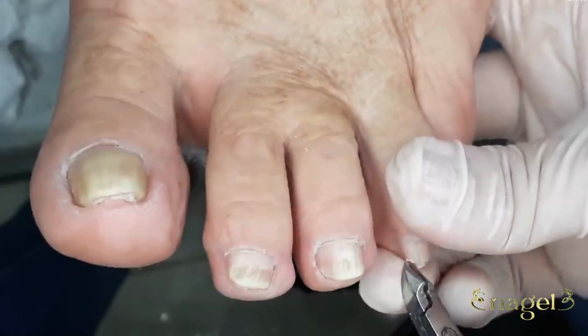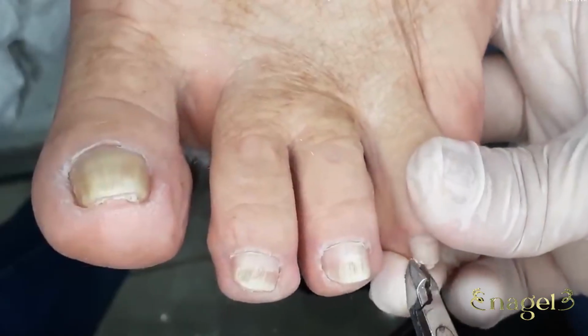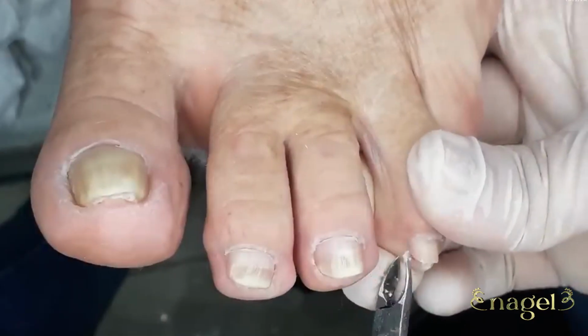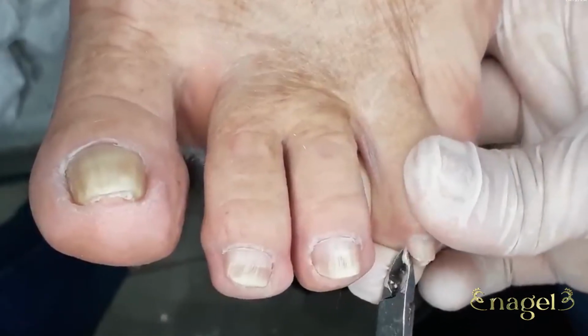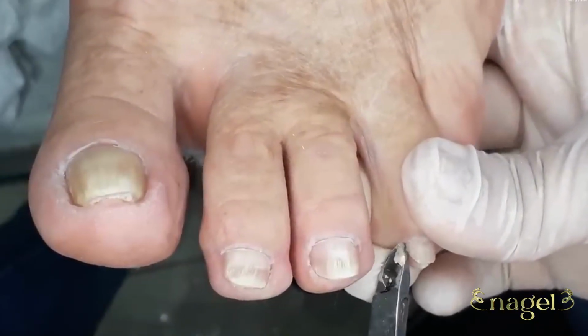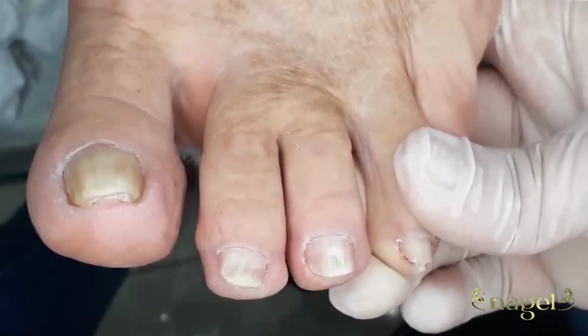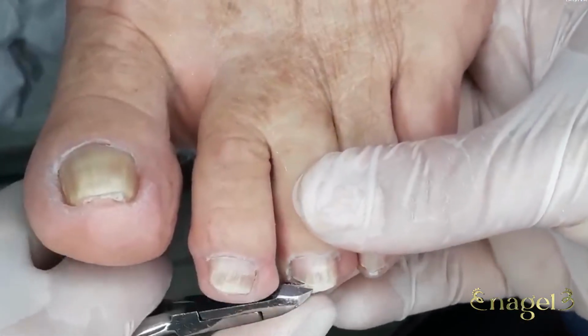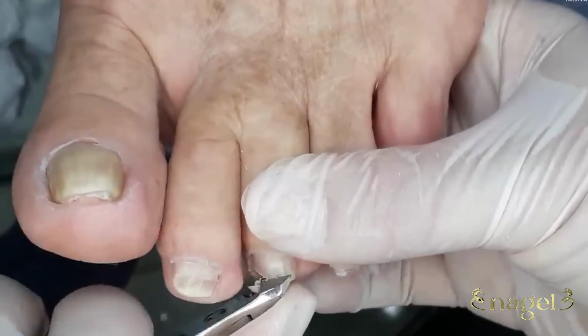My mom mentioned her last maintenance was in November or December, and since then the nail has thickened significantly. This happens because fungi thrive in moist environments, like inside closed-toe shoes, and without regular treatment they come back strong. The first step here is to reduce the nail's thickness.